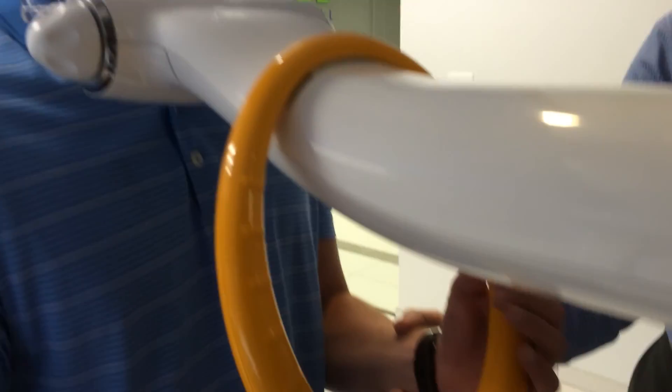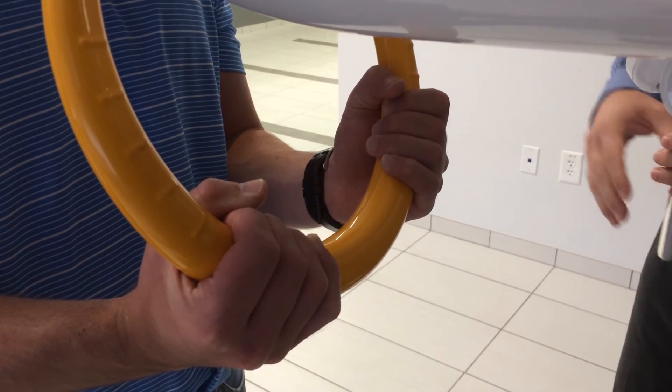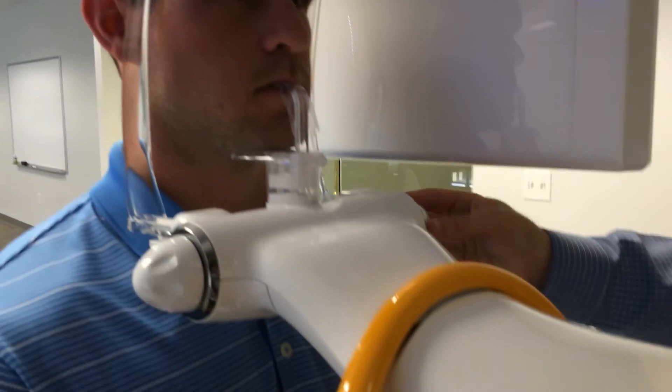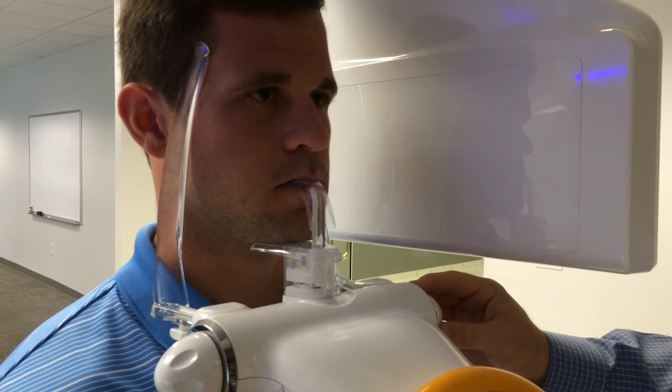JP is instructed to place their hands underhanded on the orange ring underneath the chin rest for stability. The temple supports are then gently turned in to give the patient awareness of their position and reduce free movement.